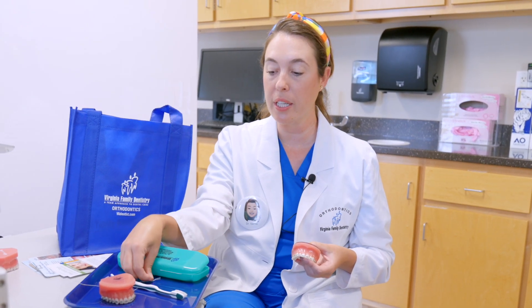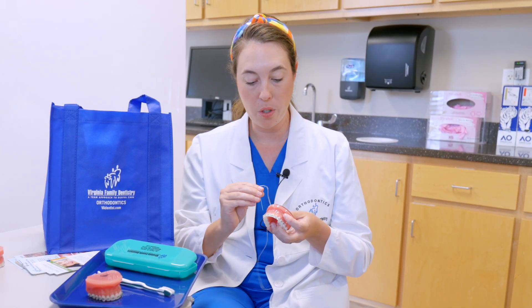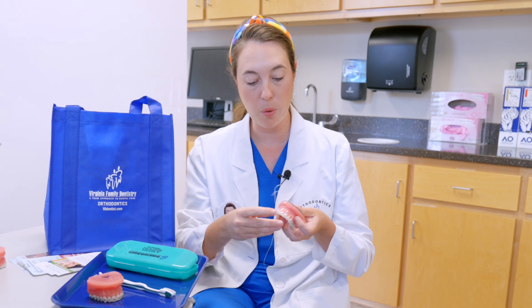In addition to brushing, flossing can be tricky. We do have these floss threaders that can help weave in and out of the braces. You can use this and it just goes in between the wire, and then you can floss like normal.